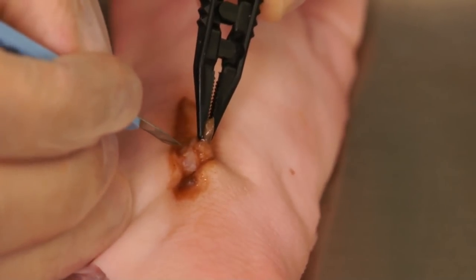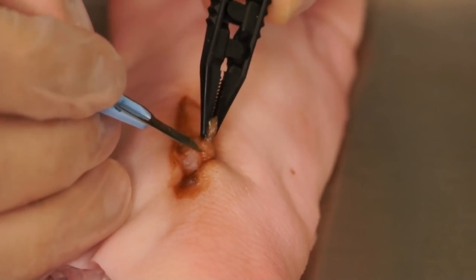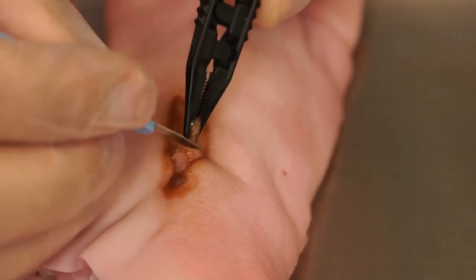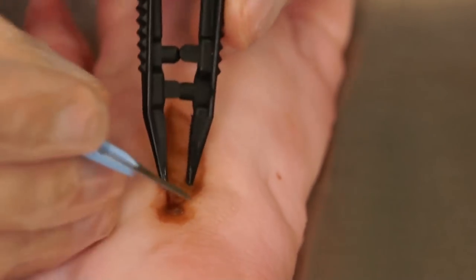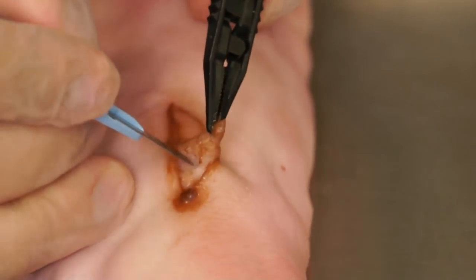Tension is maintained on the black eschar and the interface between the subcutaneous and the epithelial tissue is incised with the scalpel. Using the edge of the scalpel and the body of the blade, adequate incision can be performed.